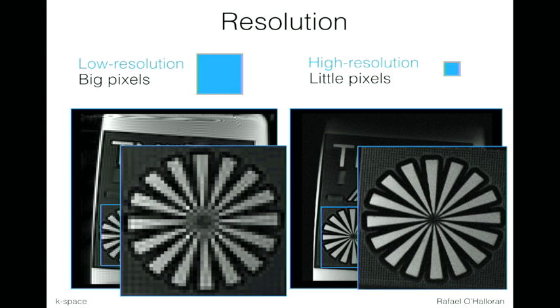And if I zoom in on this wheel, you can see the consequence of this. At some point with the blocky pixels, I lose the resolution in the center of this little wheel. And it was made specifically to show this in sequences.